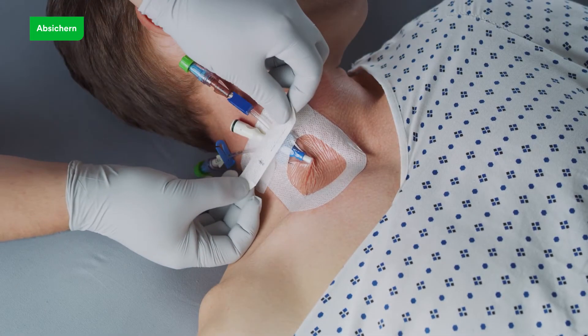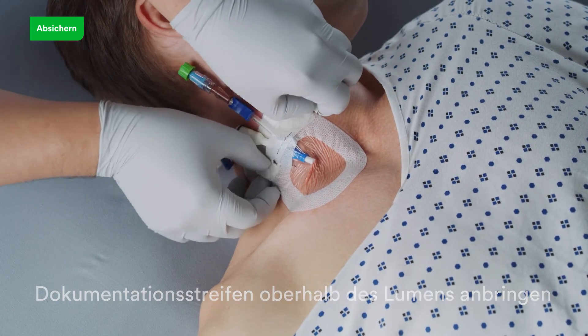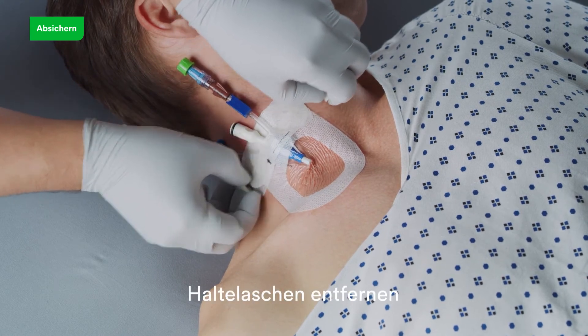Document the dressing change information on the documentation label. Apply the documentation label on top of the dressing over the catheter lumen or lumens. Remove adhesive-free tabs.